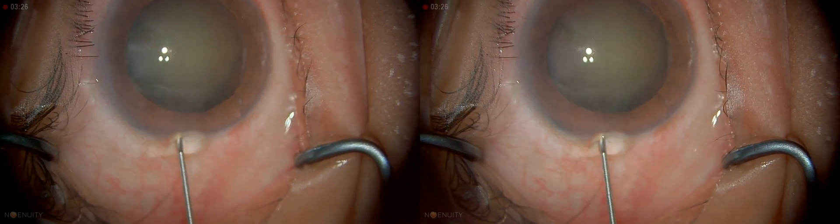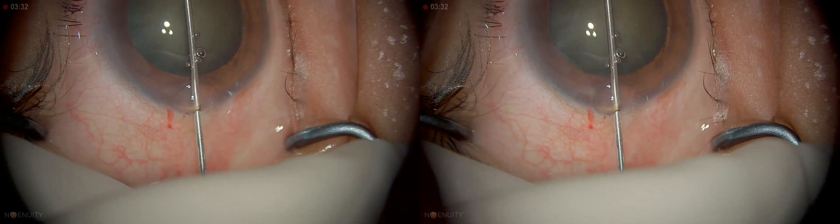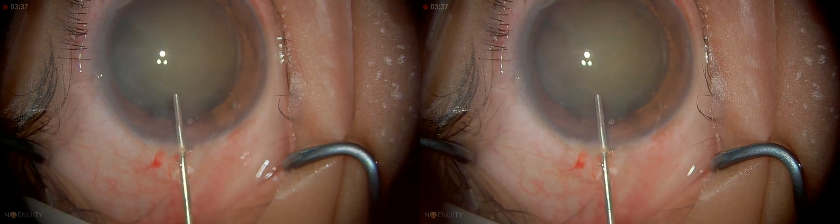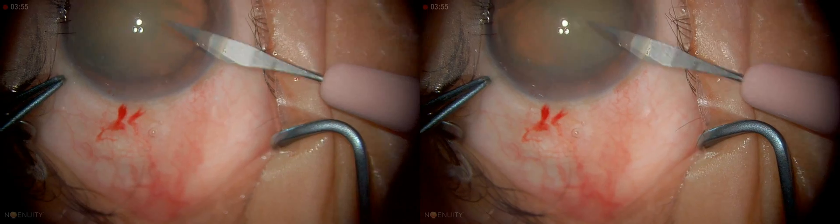This is Viscote which I'm injecting, and I'm just going to inject a little bit at the wound edge, then fill the entire anterior chamber with Viscote. Now I'm going to make two sideport incisions.